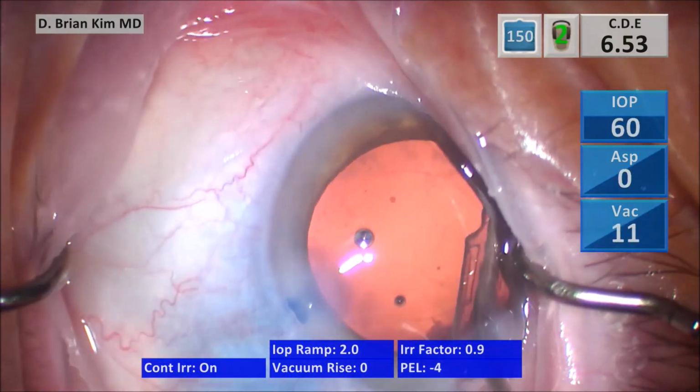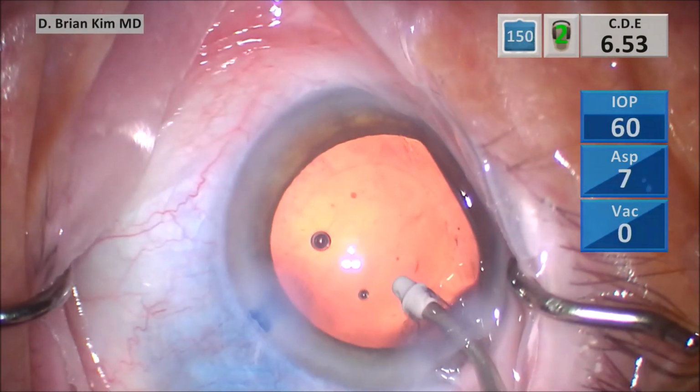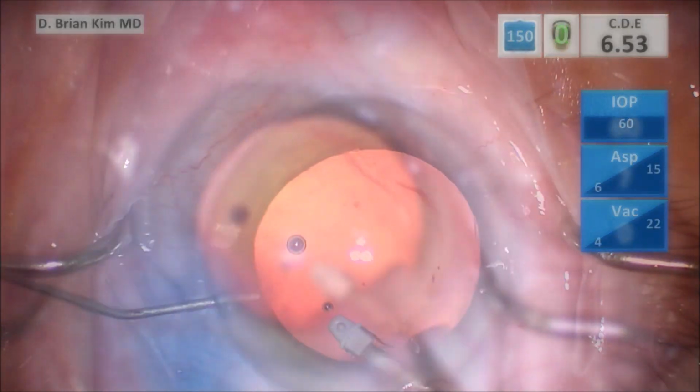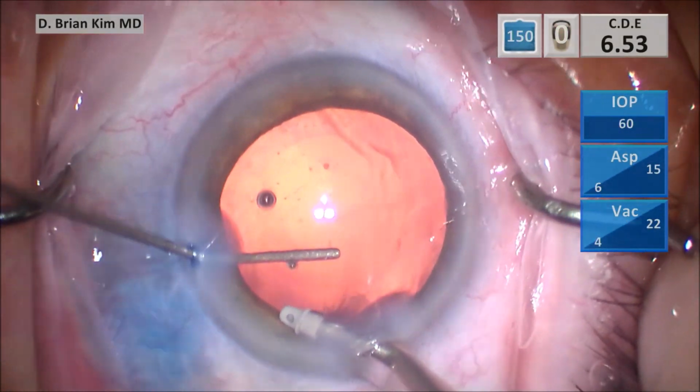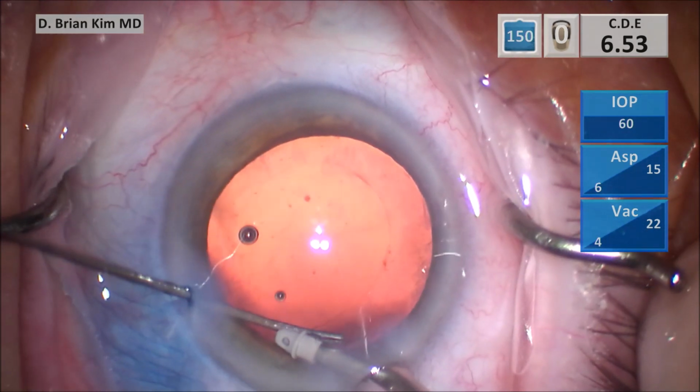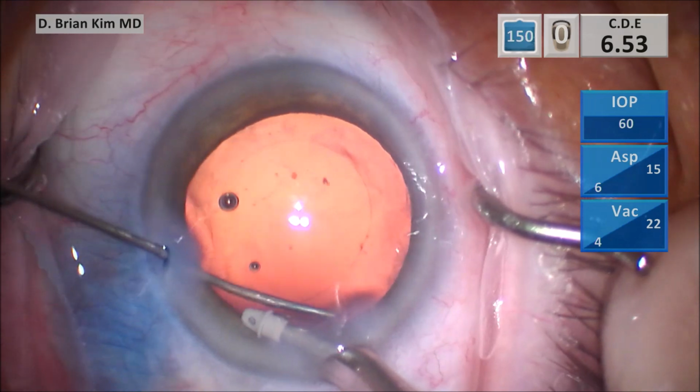And so you'll see here that the posterior capsule kind of bows upward anteriorly. I'm very careful with my pulsing of the subincisional space with the BSS because the posterior capsule is kind of more in a convex position.